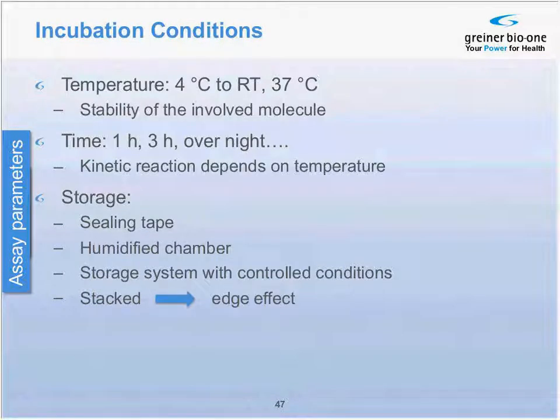As the reactions involved in ELISA are kinetic reactions, conditions like incubation temperature, time, and storage conditions play an important role for the performance of the assay. Incubation temperatures range from 4 degrees Celsius to room temperature and sometimes even to 37 degrees Celsius. The choice of incubation temperature impacts the stability of the involved molecules.